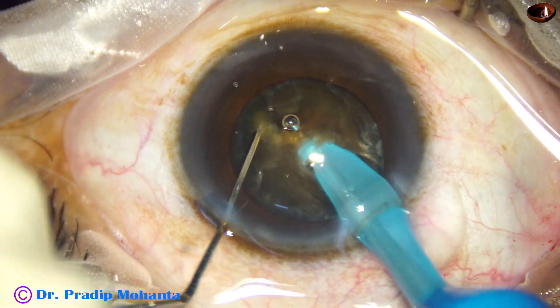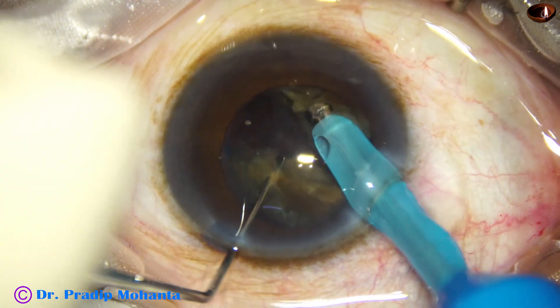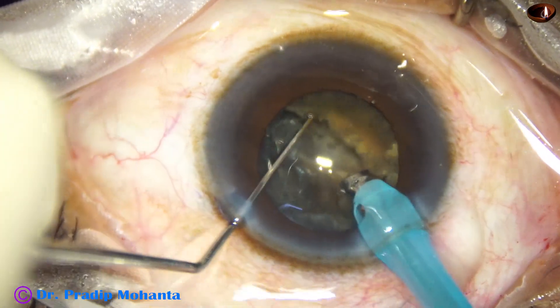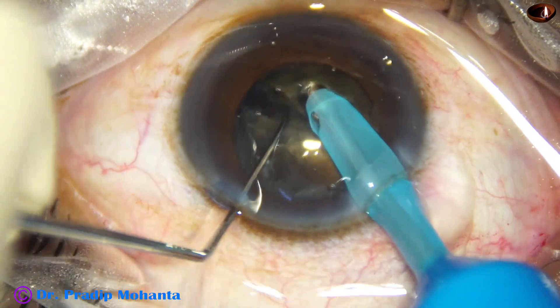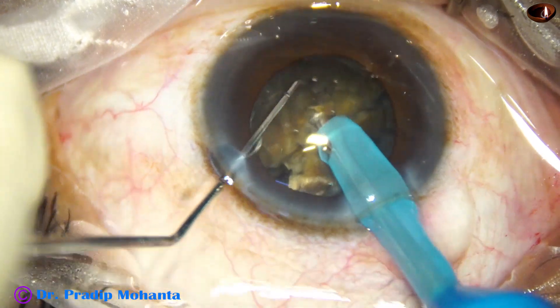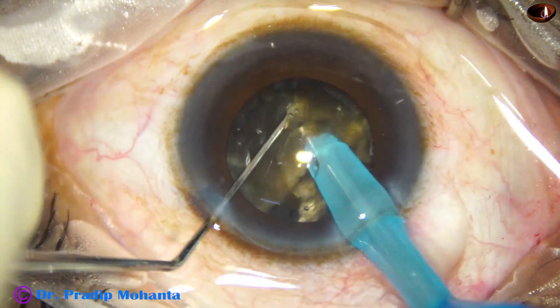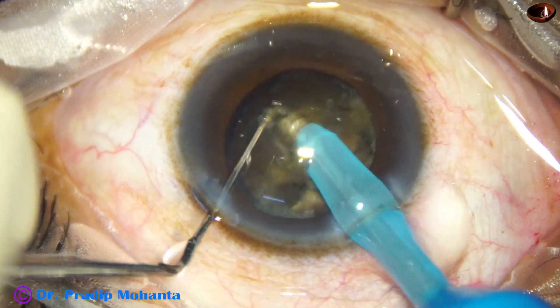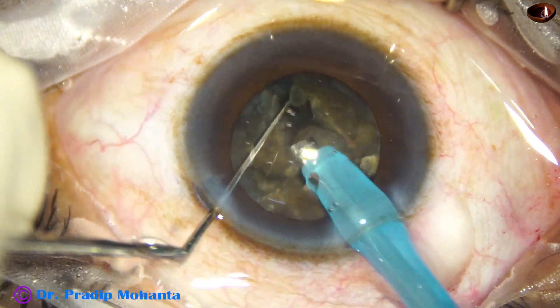As I reach near the opposite equator, I use the chopper to get a nice crack — multi-level cracking. Now I rotate the nucleus 180 degrees and separate the two hemi-nuclei completely. And now I am going to divide each hemi-nucleus into three pieces. This is one piece; then I go through this large fragment and divide it. Thus this hemi-nucleus has been divided into three fragments.